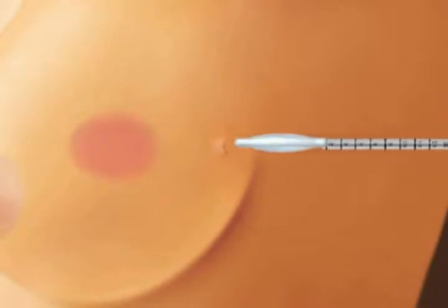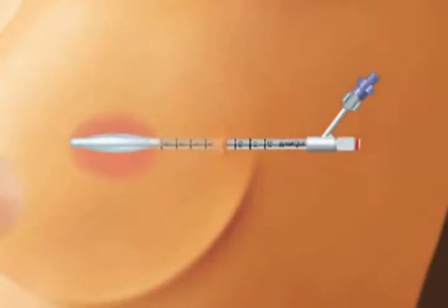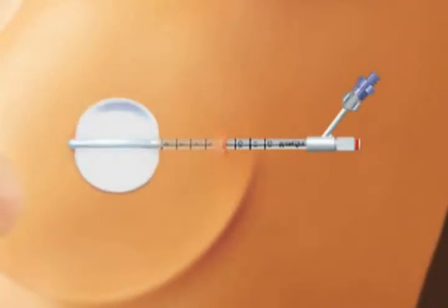After the lumpectomy, the surgeon places the mammosite balloon into the center of the surgical cavity. The balloon is then inflated to optimally position the breast tissue to receive the radiation dose. During the radiation treatment, the mammosite catheter is attached to a machine that houses the radiation source. A thin wire with a tiny radioactive seed on the end moves up the catheter under precise computer control into the center of the balloon. The seed irradiates the tumor site and the area immediately surrounding the cavity where tumors are most likely to recur.